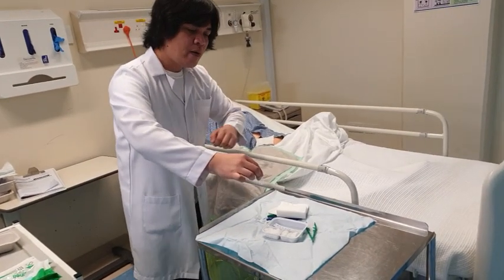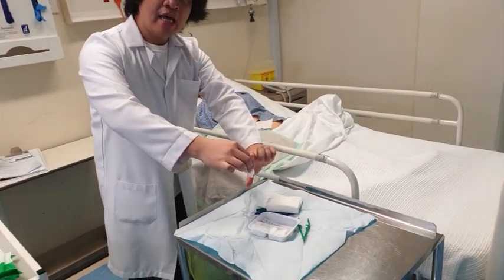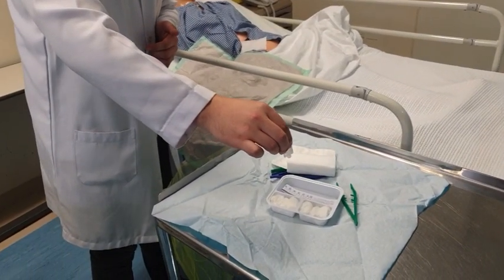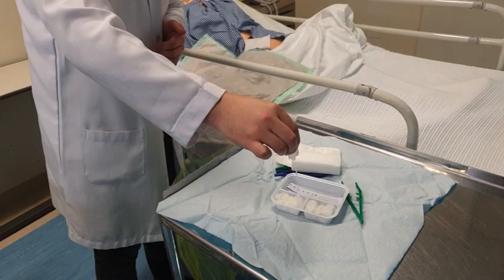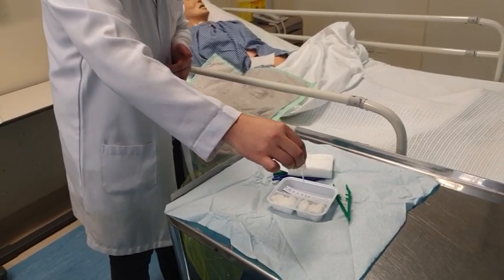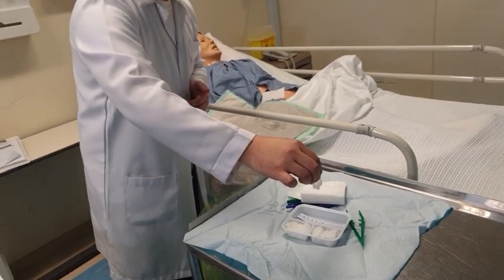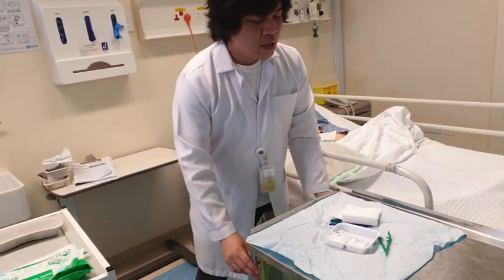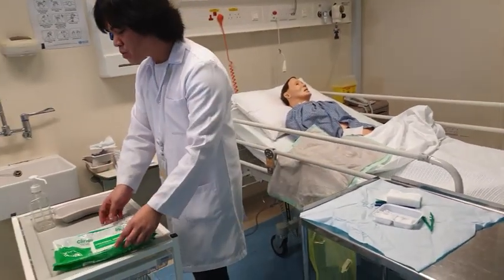And in doing so, make sure to maintain a higher distance in order not to touch our table. Make sure that the cotton or the gauze that we are using will be soaked with normal saline. And then we can dispose this one. Okay? So our table is ready.